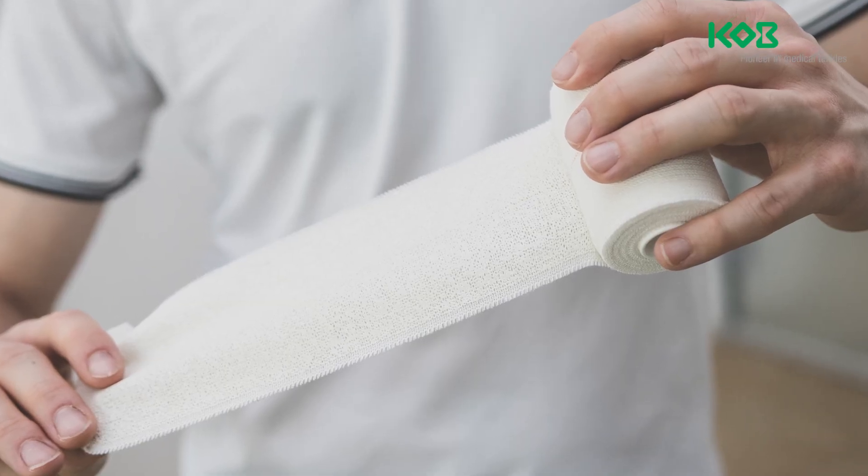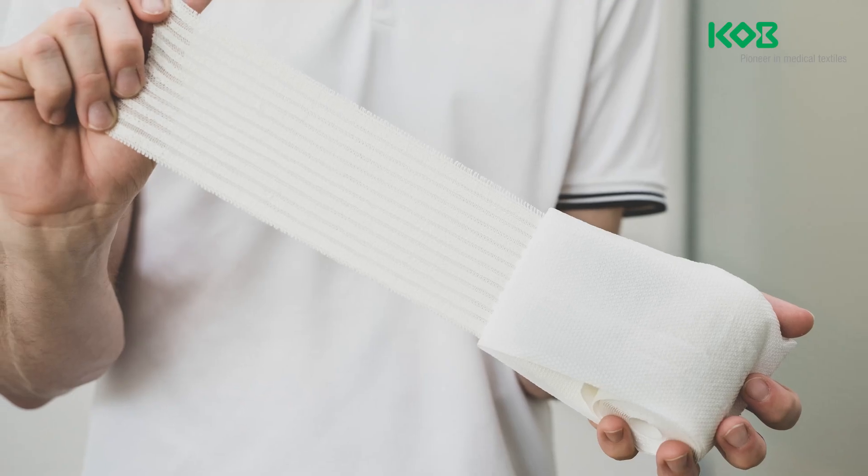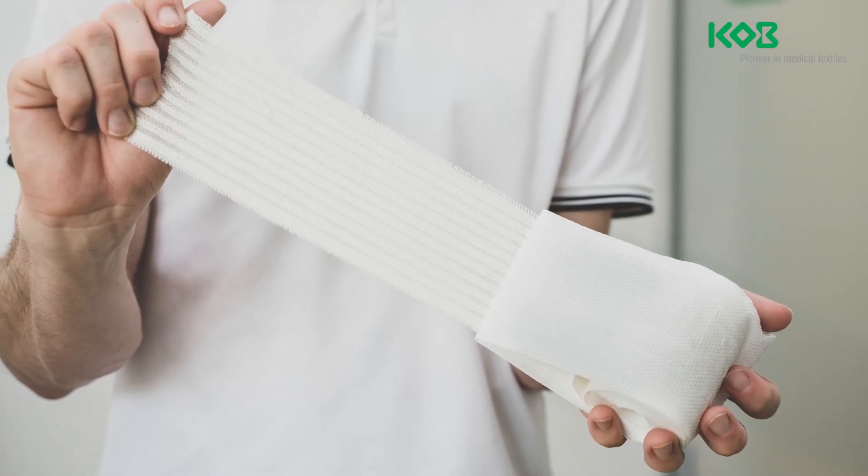Bravo Plast is available with a centerline and full coverage adhesive application, as well as a French variant with strip application.